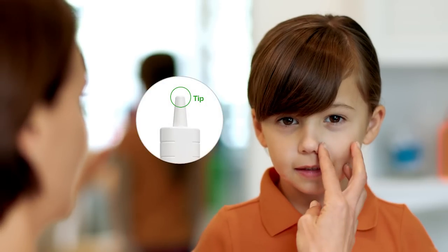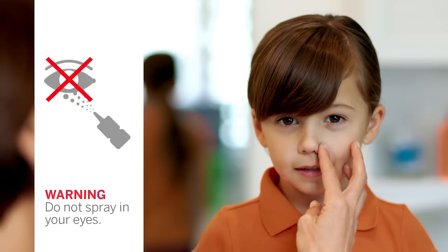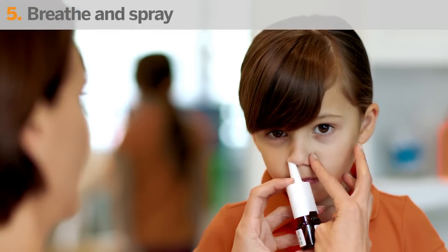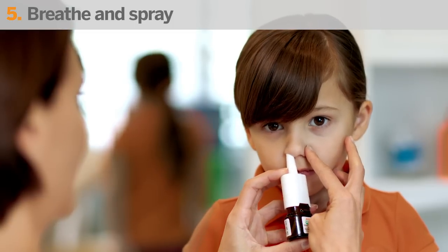Now, close one nostril and place just the tip of the spray nozzle in your child's other nostril. Be sure to aim slightly away from the center of their nose. Be careful not to spray into their eyes — Children's Flonase is only to be used in the nose. While having your child sniff in gently, press down on the spray nozzle once. They should feel a light mist in their nose.